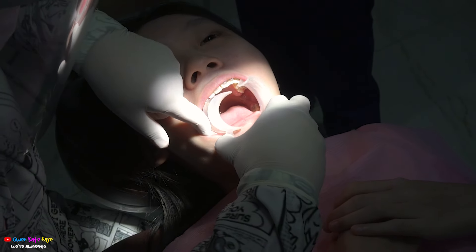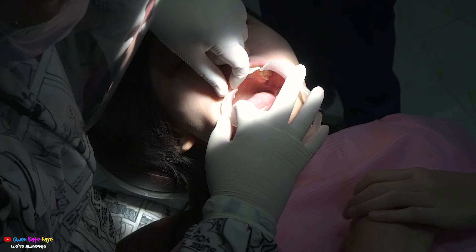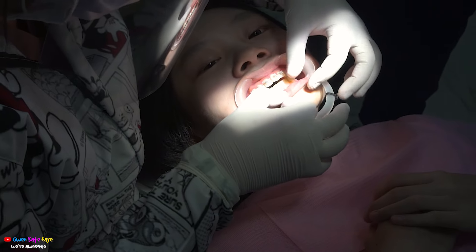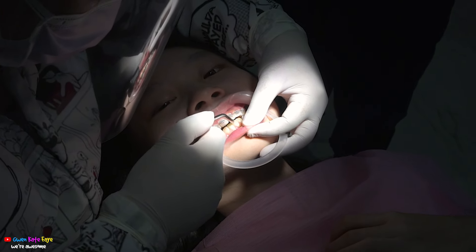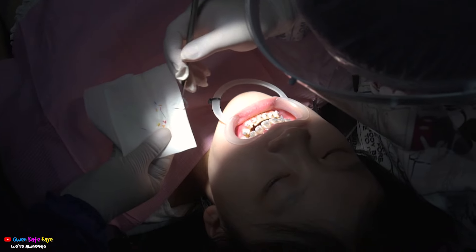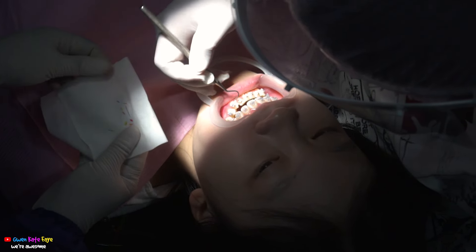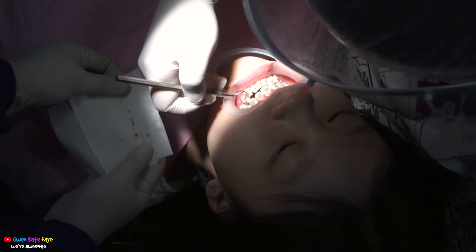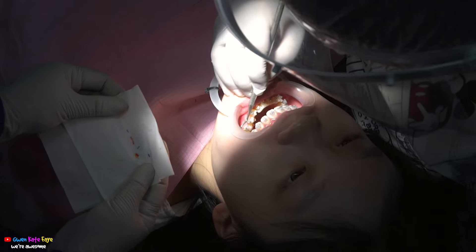It's time to put on the bottom braces. I wonder if the bottom part is going to hurt, but let's hope it's not. Fast forward — my bottom teeth already has all the brackets, just need to do the wires now. Let's just hope putting on the wires won't hurt.